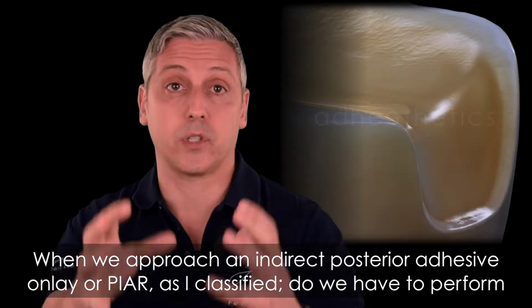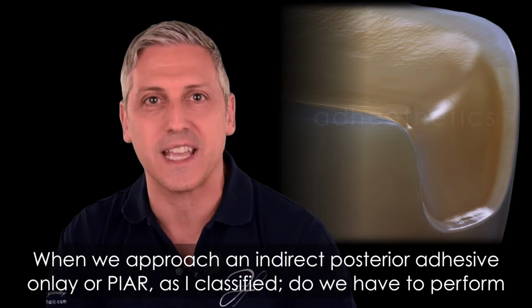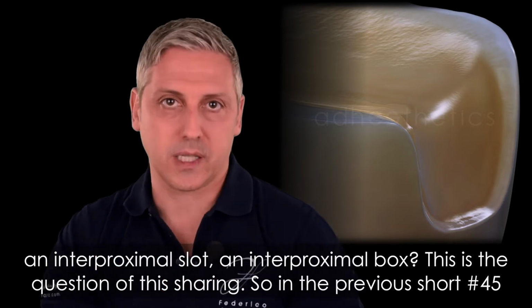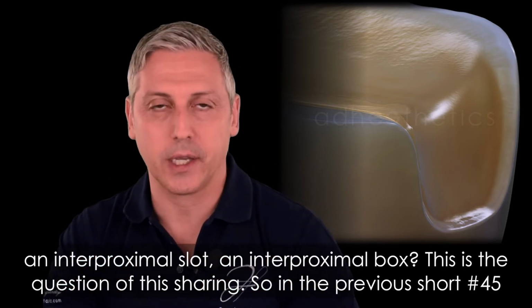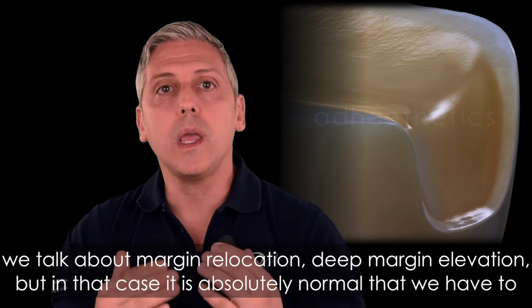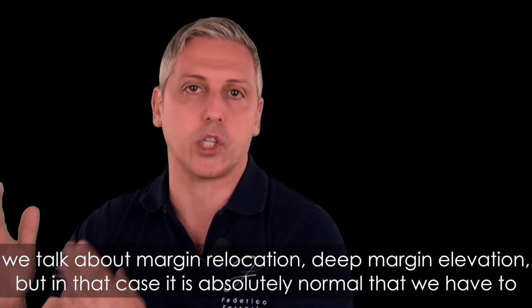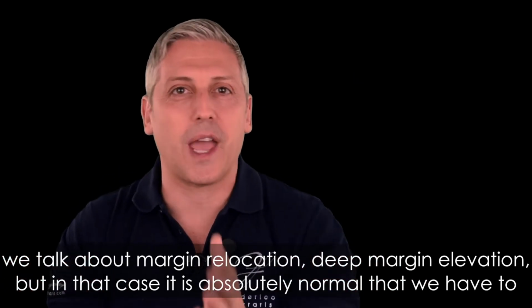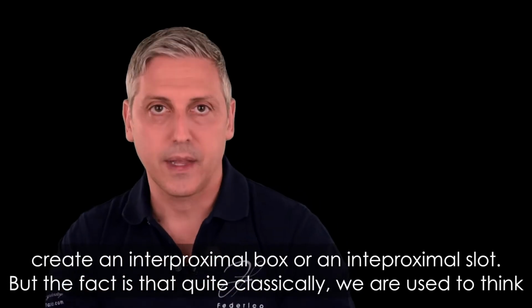Approach, an indirect posterior adhesive onlay, or PIAR, as I classified, do we have to perform an interproximal slot, an interproximal box? This is the question of this sharing. In the previous short 45, we talked about margin relocation, deep margin elevation. But in that case, it's absolutely normal that we have to create an interproximal box or an interproximal slot.